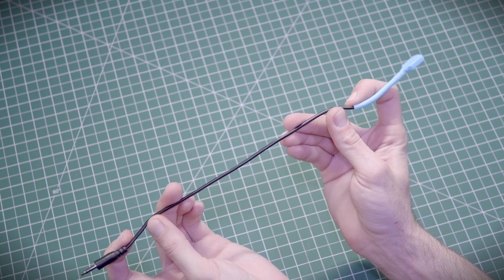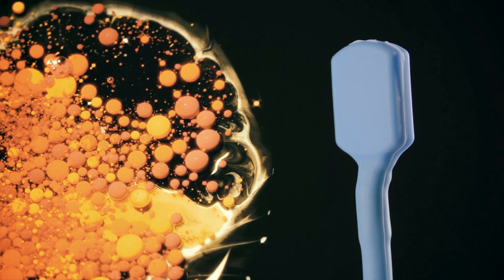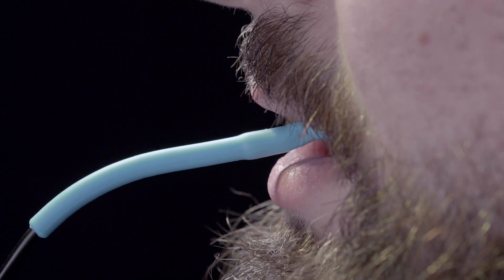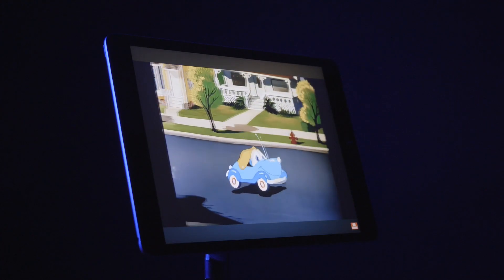The ByteSwitch is attached to a 12 inch long malleable wire and covered with FDA compliant food grade silicone. Place the switch into your mouth and activate it with a light bite. A soft tactile click lets you know when the switch has been pressed or released. Send nearly any command with a gentle bite.